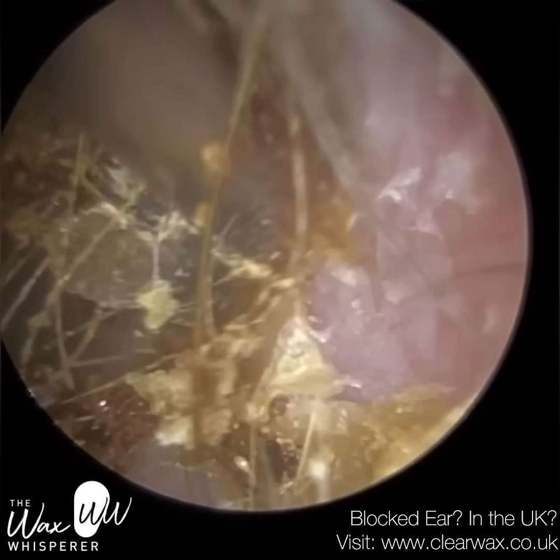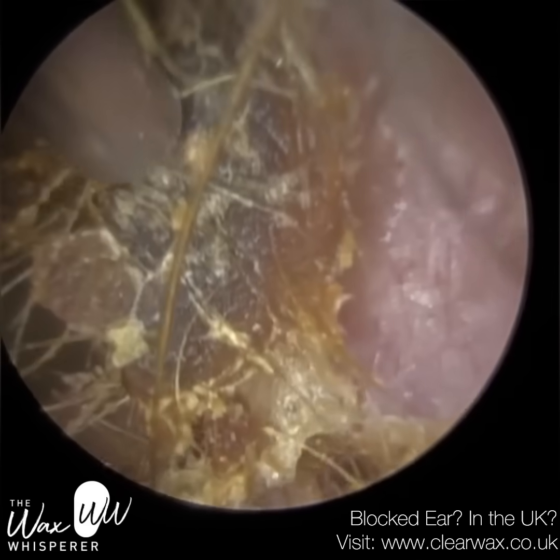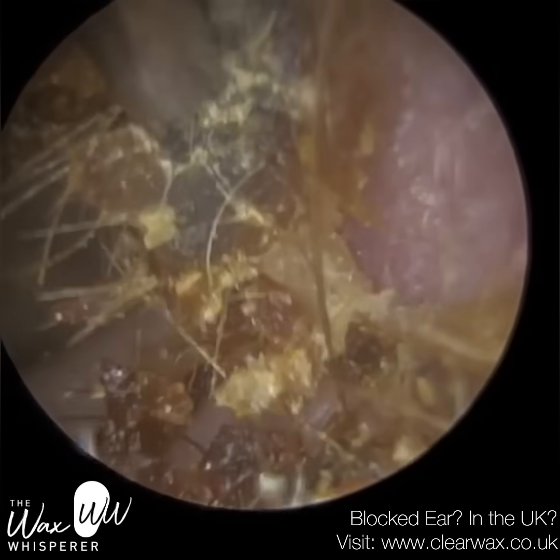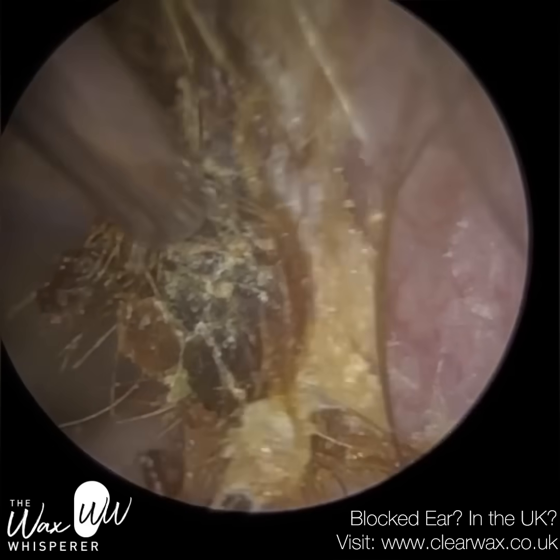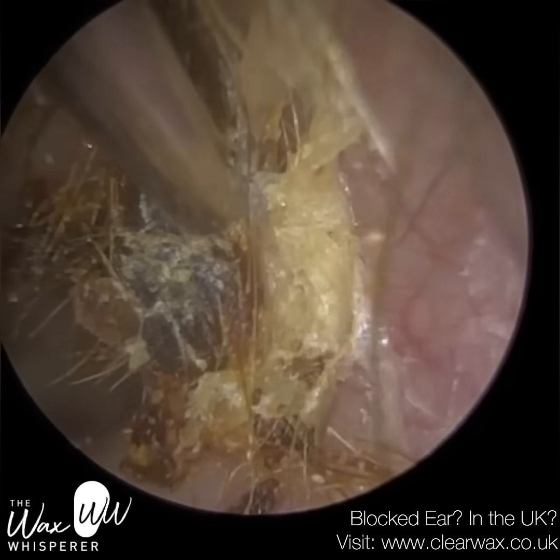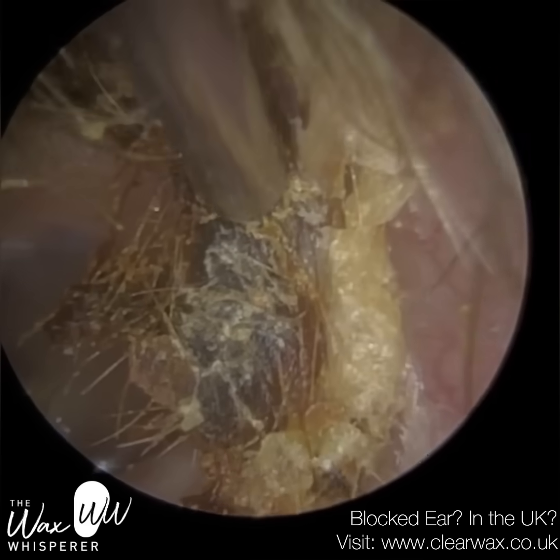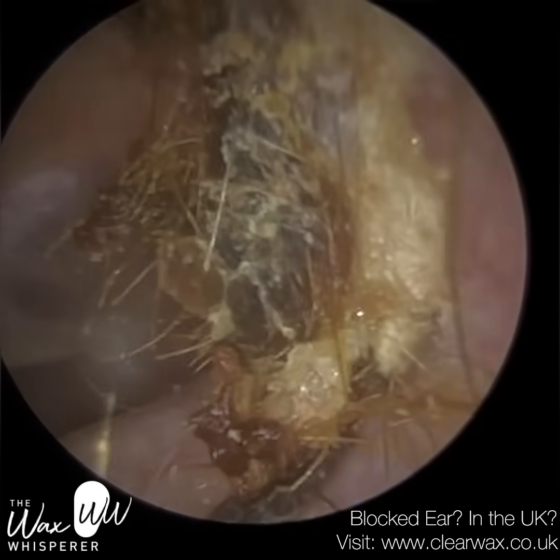The bone begins to decay as a result because it's not receiving the nutrients, the blood flow that it requires. Sometimes also the ossicles can start decaying if there's an active infection in the middle ear. There's bacteria there, there's fluid build-up, and that fluid's infected, so glue ear, for example. But in this particular patient, they rarely suffer from an infection in the middle ear. It's just the eardrum is always sucked in. So that the long process of the incus was slightly deformed as a result.